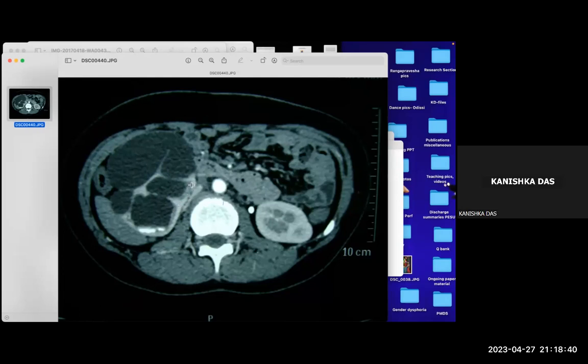Gross thinning of the cortex. Is that the lower pole of the kidney that's made out, sir, below the mass? Right here. Yes, sir. What do you think this will be? What is going to come in that position there? Part of liver. Yes, it's liver.